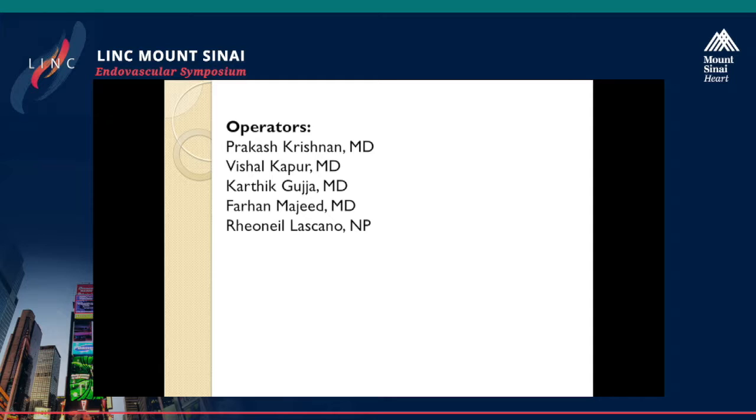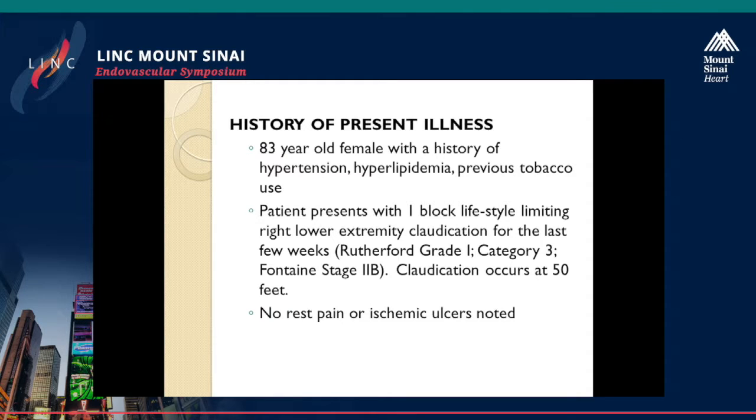So we prepared a phenomenal case and a very controversial case of common femoral artery disease. As we discussed, we want to be able to discuss some of the controversies that we have, and technically, this definitely has a lot of discussion points. So without further ado, I'm going to ask Dr. Majid to present the case.